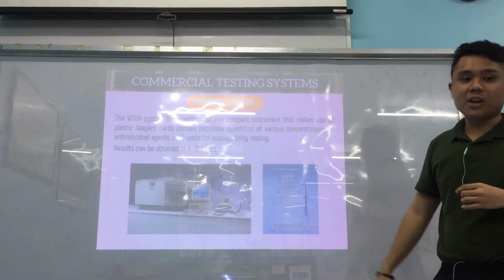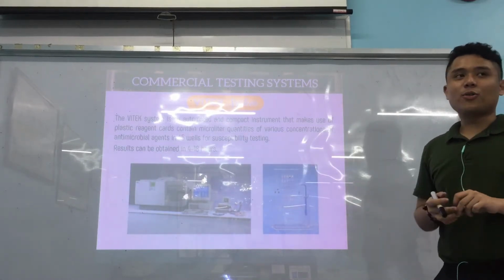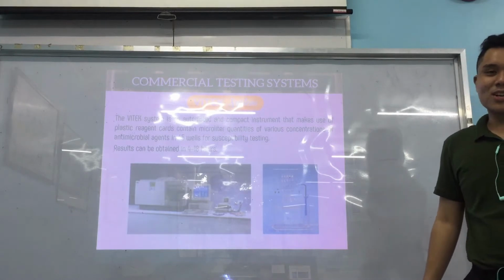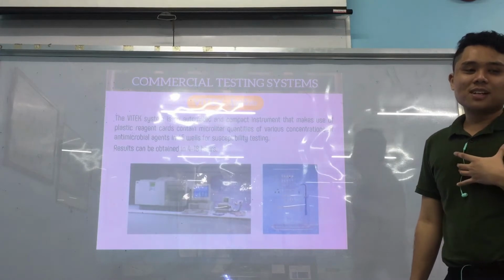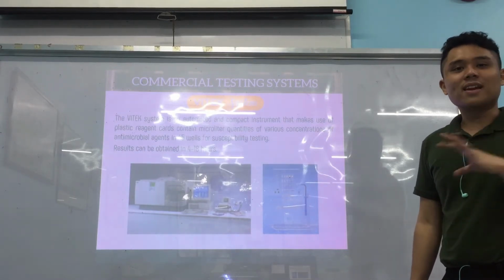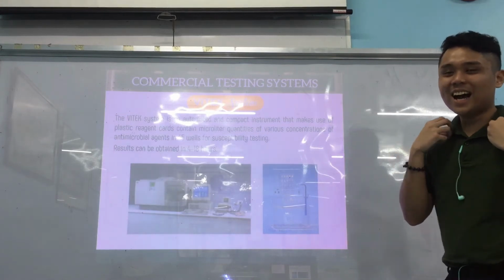Actually, this is a common machine in microbiology labs in routine laboratories and hospitals. I have seen a Vitek, but I have no experience manipulating it, like loading the antibiotics, whatever. The medtech assigned to it has a somewhat complicated job. For example, if I'm on duty at night, 2 to 10 at Soto in micro, and you're the only one there or there are only a few of you, and then suddenly there's a sound like something is attacking, you get scared.